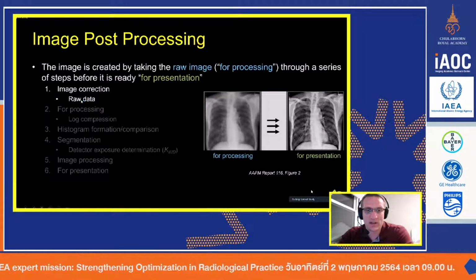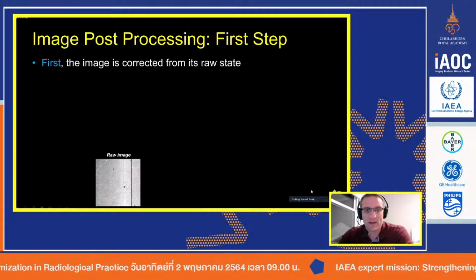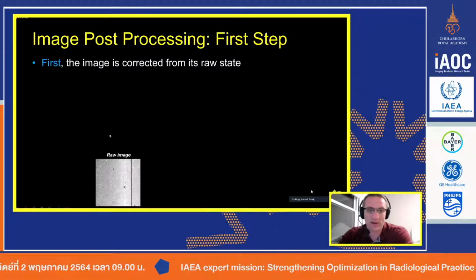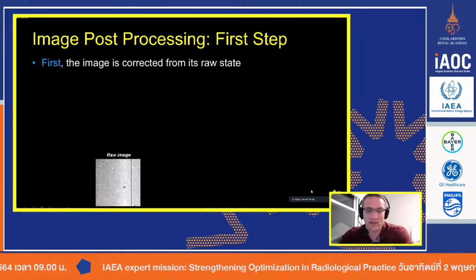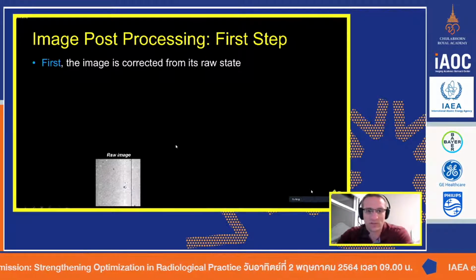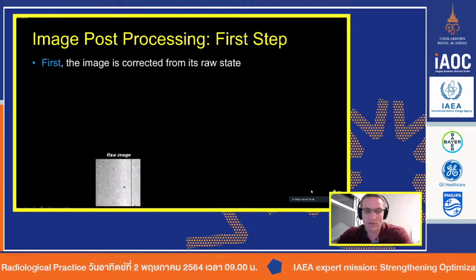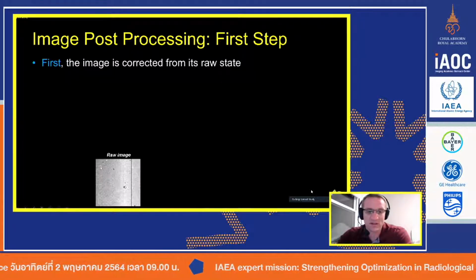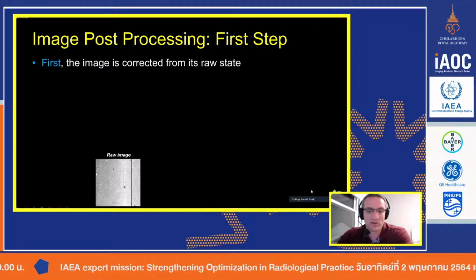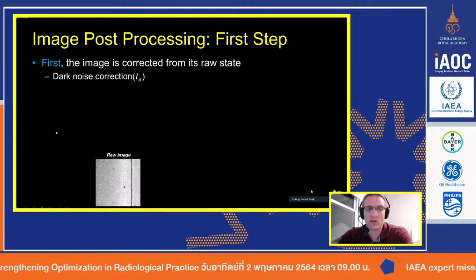And so we're going to take the raw data, the raw system data, and we have to make it clean. And this is something that actually happens every day, and the technologists should be doing probably about every month. So the system, if you actually just put the detector in, took a picture without anyone in between, not imaging a patient, and we turned off all the corrections, you would see lines through it where some of the pixel units just don't work. You'd see little dead spots where that pixel is dead, and white spots where the pixel is stuck on. So no matter how many photons it gets, it reads out a large number. So we can correct this.